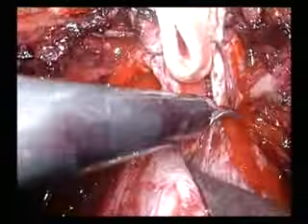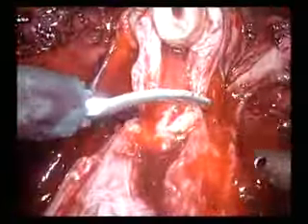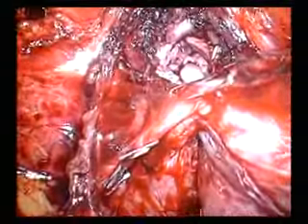As soon as the urethral catheter becomes visible, the assistant retracts the catheter towards the symphysis. The verumontanum is now clearly visible. The dissection of the posterior urethra starts distally to the verumontanum.